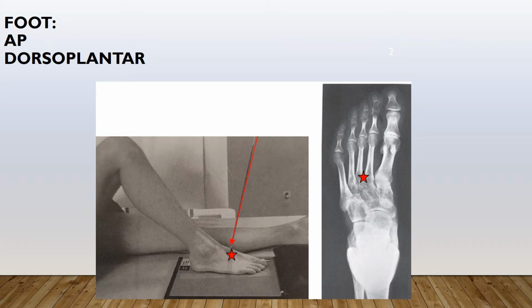So it's a little bit different in podiatry. In radiography, the best way to image a foot would be to flip the patient on the x-ray table and utilize the anode heel effect. So we have the thicker part, which is the rear foot, against the x-ray tube cathode, and the thin part, which is the phalanges, toward the x-ray tube anode.